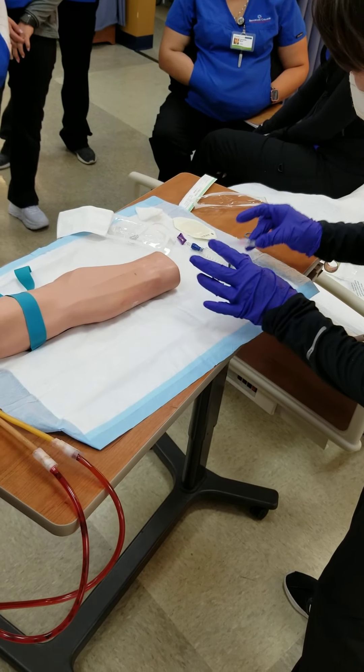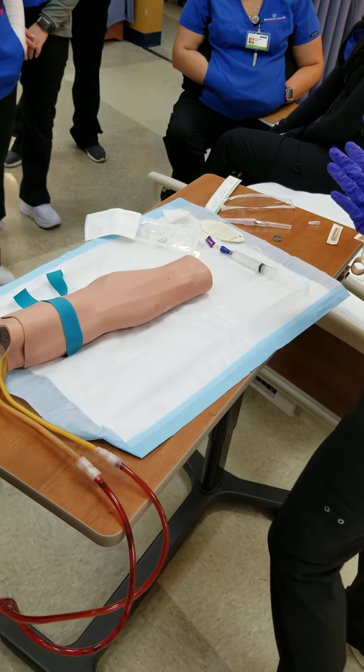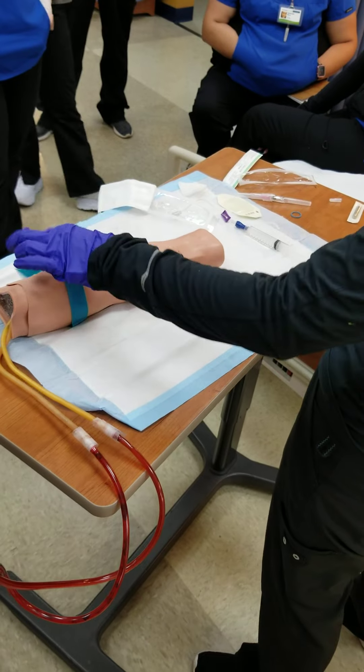Can we just leave it on the whole time? No. Because you don't know how long this is going to take. If you set this up, put it on, find the vein, wait for it to dry, and then go — yes. But don't keep this on for too long.